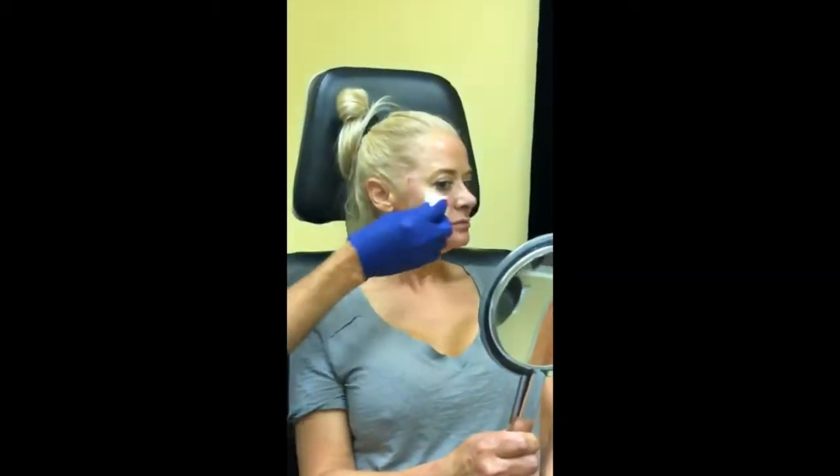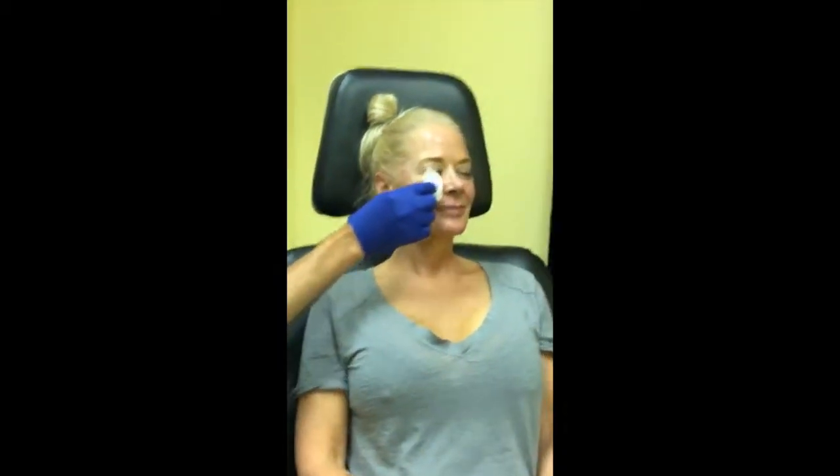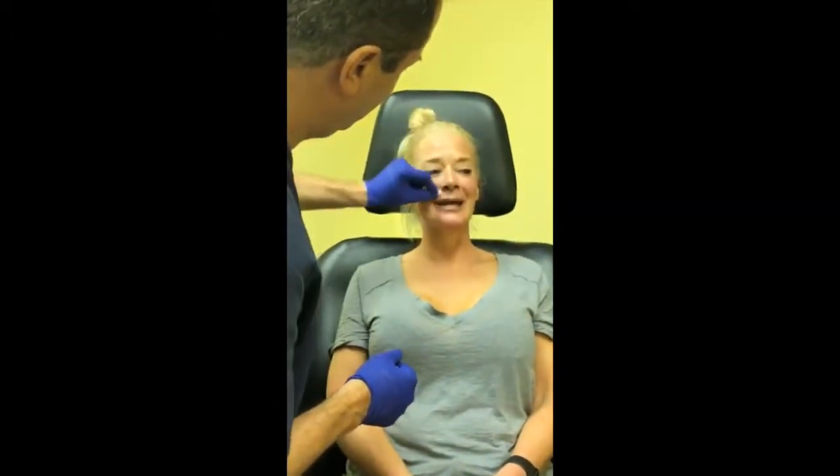Can you bulk this up where I've had some dental issues? Yes, we can do that. Tanya mentions she has a bleeding disorder, which is why there's a little more bleeding — it's not the doctor's fault. And it doesn't hurt at all.